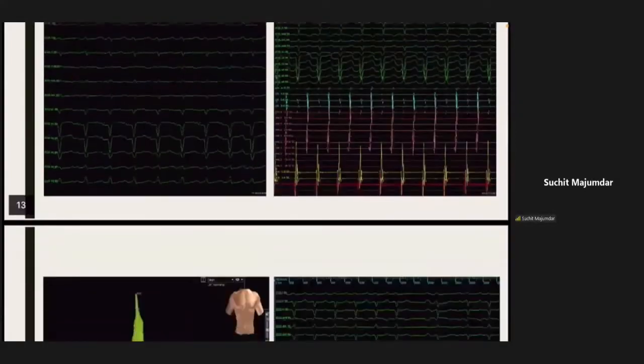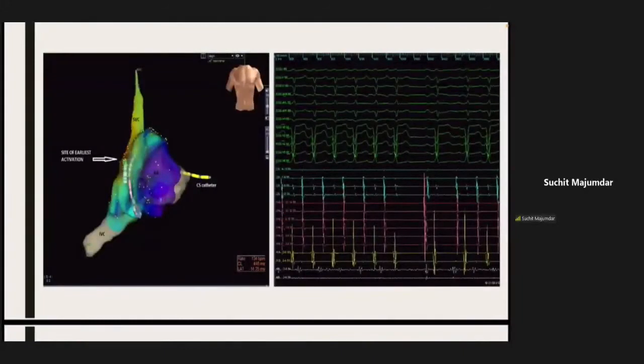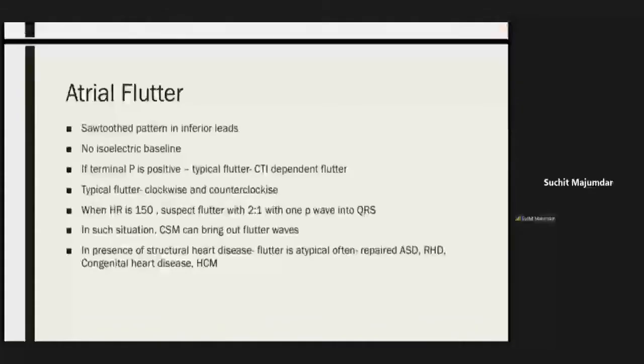This is another case where it was an atrial tachycardia coming from the crista terminalis superiorly. So we ablated this atrial tachycardia, and the patient, who had an ejection fraction of 35%, had an improvement of ejection fraction to 55% within 5 to 6 months. All these things are very gratifying when we ablate this atrial tachycardia and LV dysfunction improves and there is a mortality benefit by this.